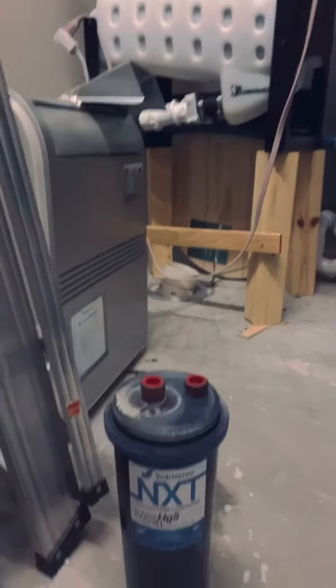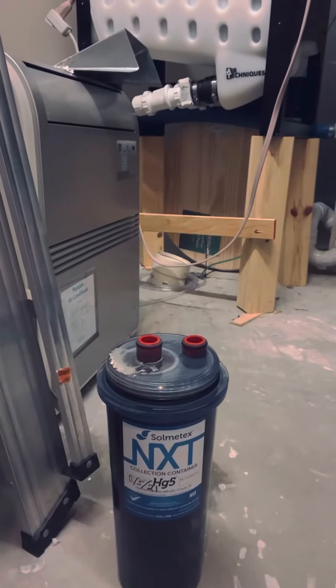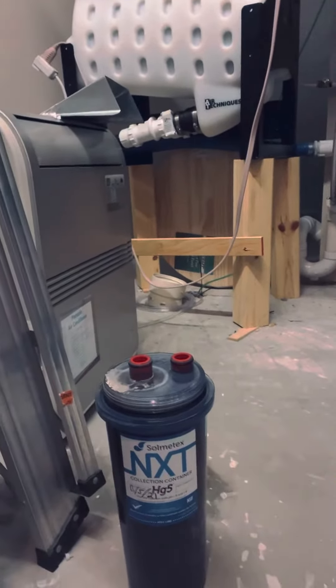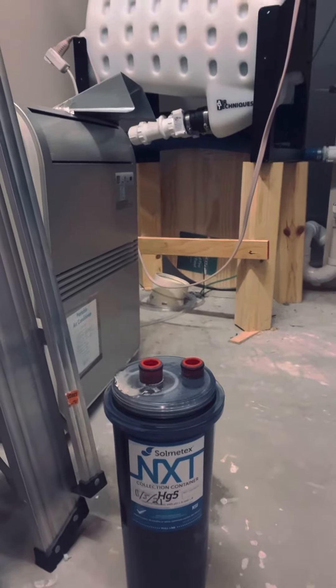If you want to see the unit we just took off — that's what we put in November. That thing is pretty heavy, and that is a cocktail you would not want. From a high level, that's what an amalgam separator is and what it's used for. I'm not positive about much, but I know I don't want that in the public water system.